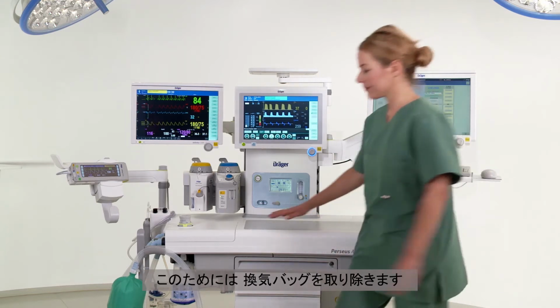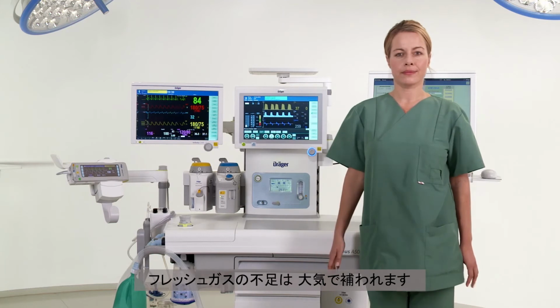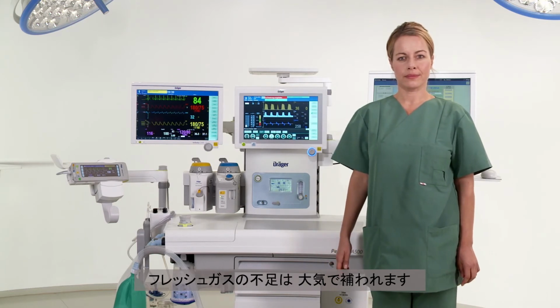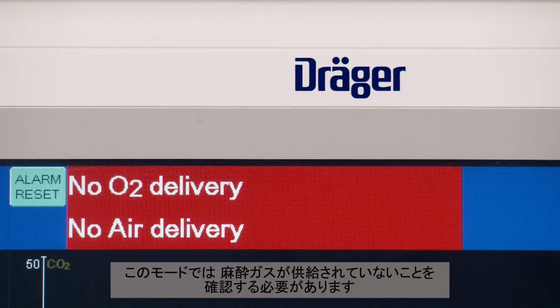To do this, remove the breathing bag. The fresh gas deficit is compensated with ambient air. In this mode, you will have to make sure that no other anesthetic gases are emitted.